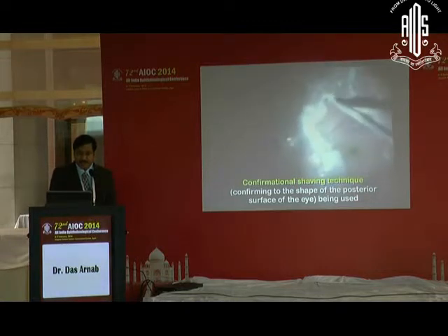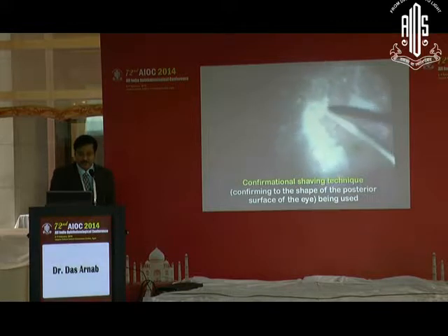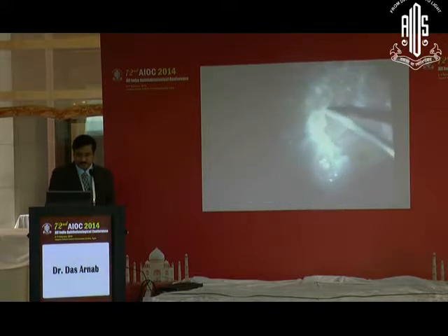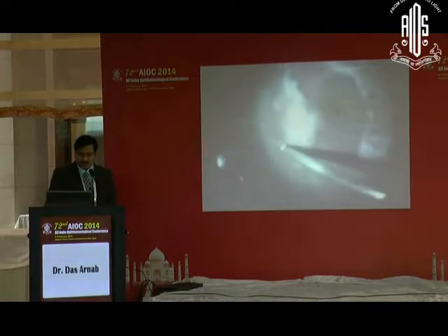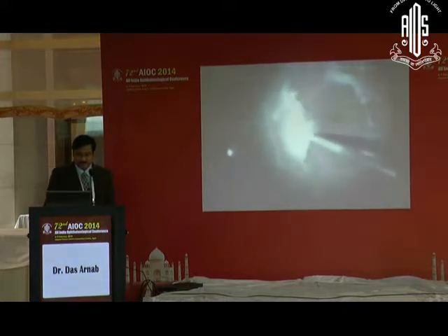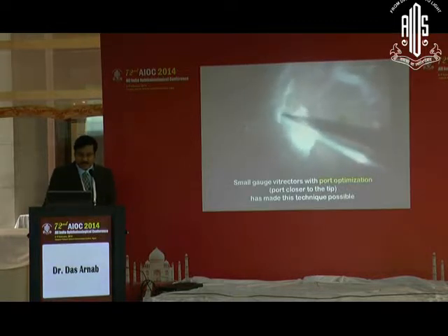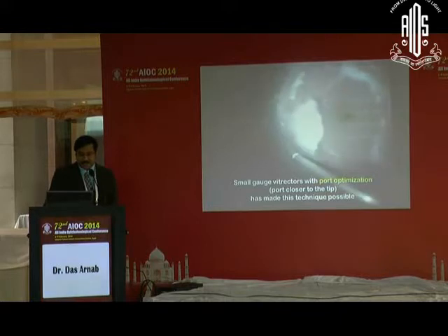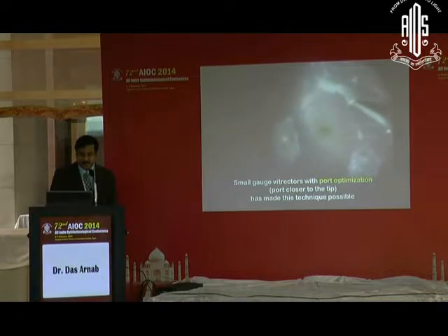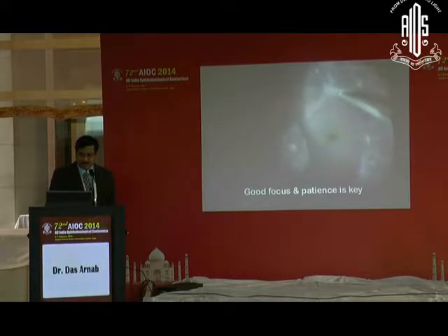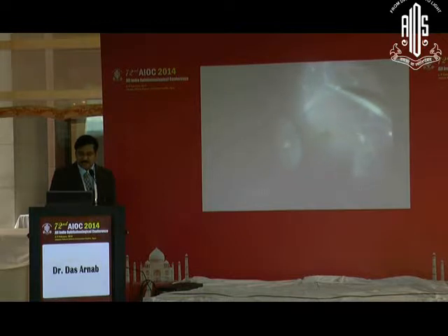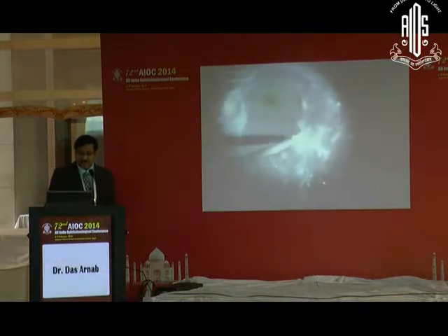There is a slight lifting action while we are shaving, conforming to the posterior concavity of the eye. It is totally avascular. The small gauge cutters with port optimization — that is, port closer to the tip — have made this technique possible. Good patience and good focus is the key for any vitreoretinal surgery, more so in diabetic cases.